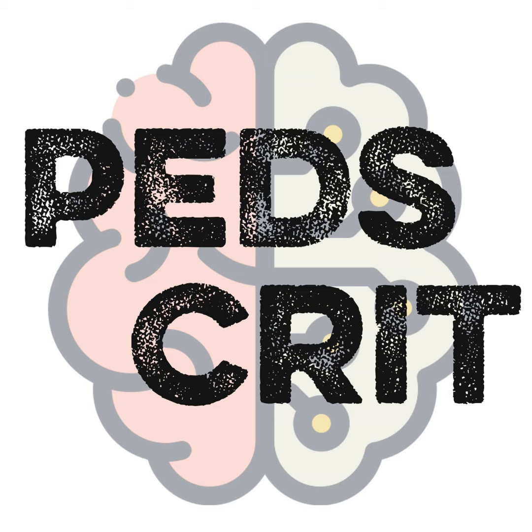I think TEGs are so neat, and definitely not something that I used prior to fellowship. It's a complex test. It tells you lots of information. There are lots of different variables that are measured. What specifically are you looking at on the TEG to give you an idea of how well your patient's anticoagulated? So the main thing that I look at is the R time. That gives me an idea of how much heparin we have in the system.